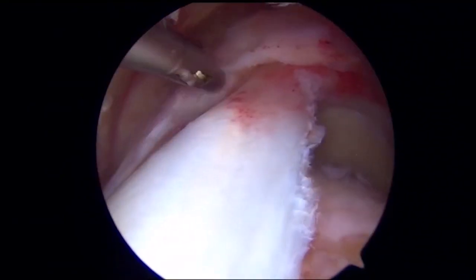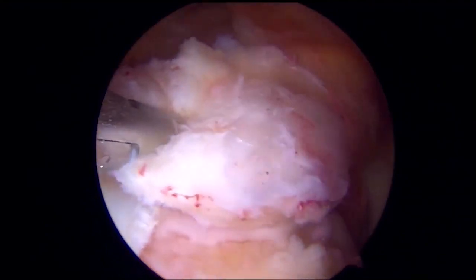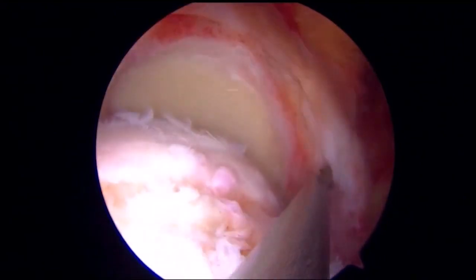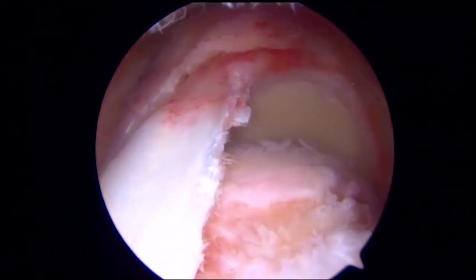When we now pull on this same rotator cuff tear, we can see that there's not dramatic lateralizability, but it is clearly significantly more lateralizable for a centimeter or more than it was before that capsule release was performed.